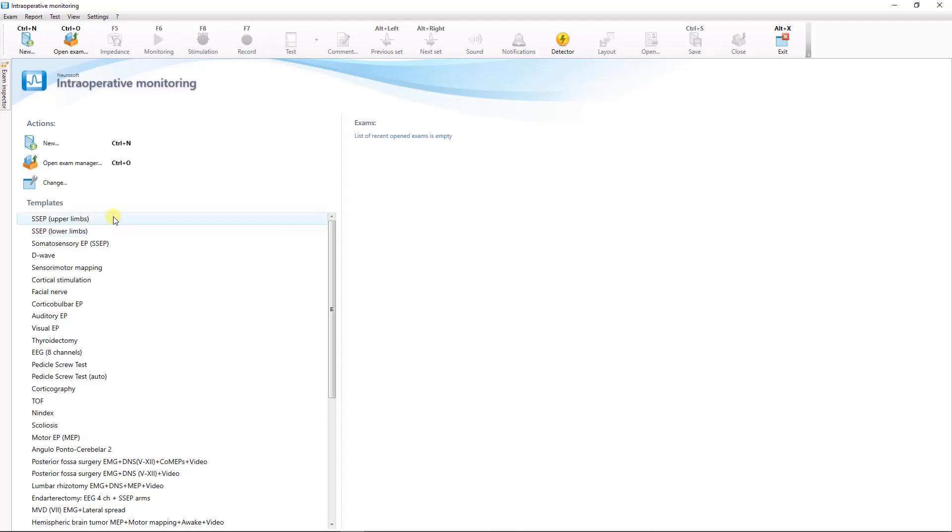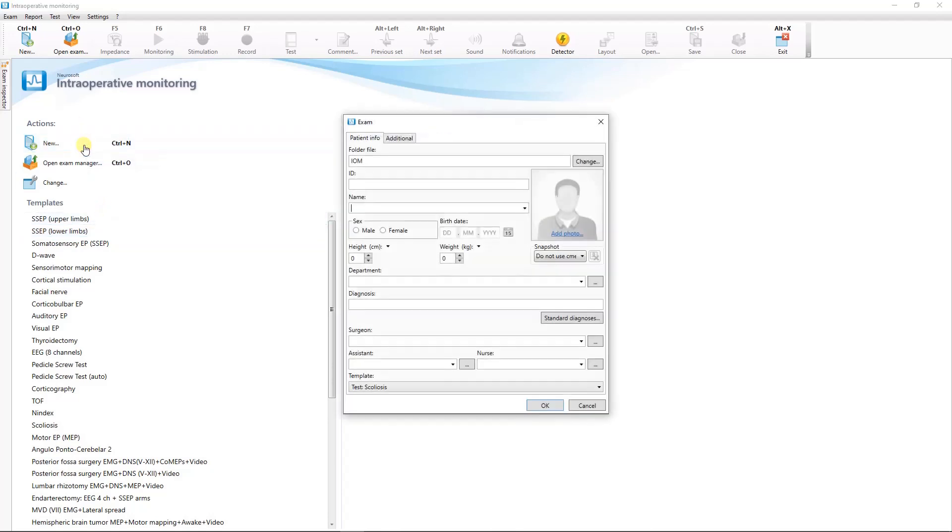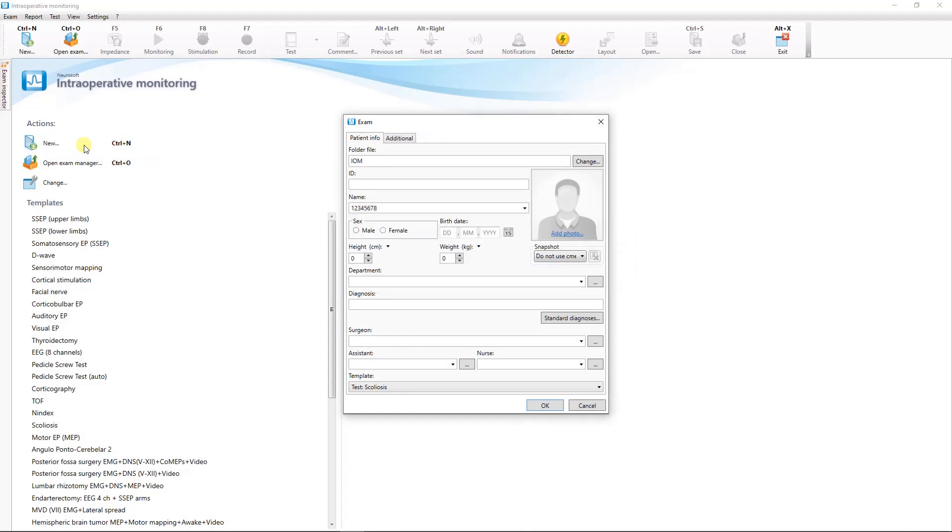You can also start monitoring by clicking the new exam button and in the appeared dialog box enter the patient's data and select the test template from the list.